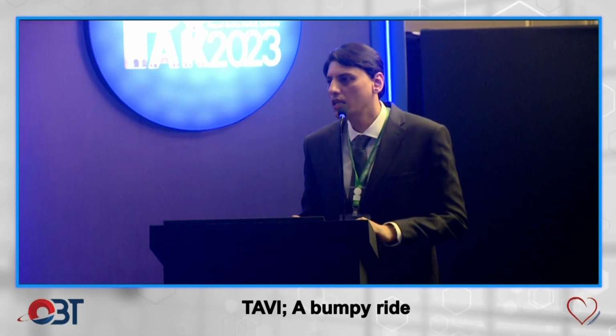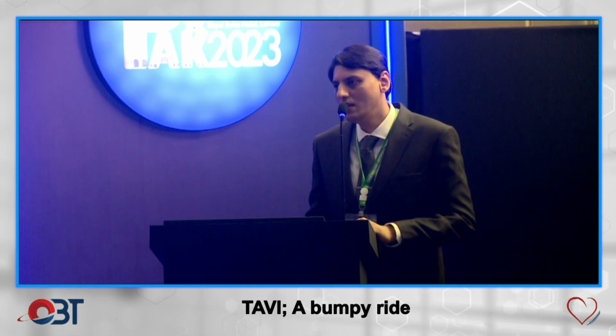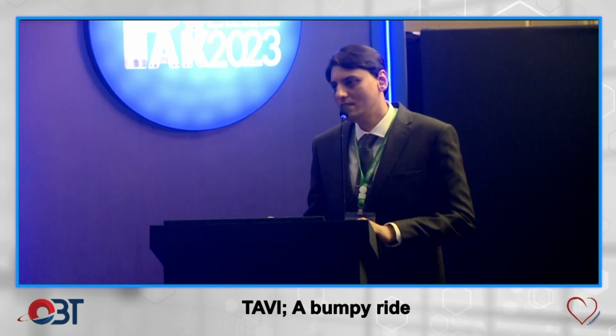Another important point, Ali, you would also be looking at the takeoff of the aorta, how it is aligned, because if it is vertical, it is easier to implant the valve. Otherwise, if it is horizontal, it is going to be difficult. That's why I said that I would have used the wire in order to push and pull, and that's the point which sir said, that horizontality of this aorta affects it. There are a lot of technical issues in it, but you did a very wonderful case and you should be applauded for this case. But it is right that you check everything, and the horizontality, verticality, all these things matter in this.